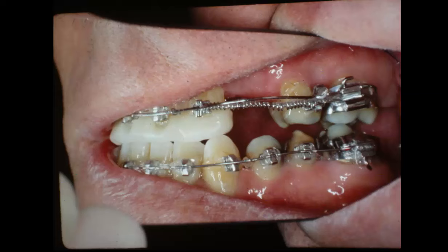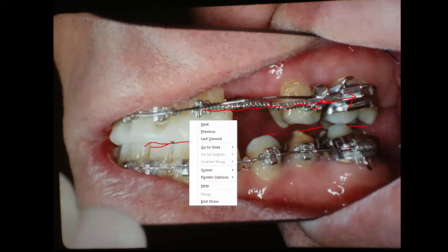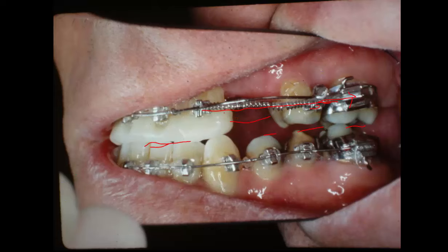Now, this is a little blown up deal, but while we were opening this bite, in other words, we had these teeth separated, we started expanding these teeth to the buccal. Also, I put a spring on the regular arch wire in here, and we're opening the gap where these teeth were missing, where it was closed up. So there's a whole bunch of things going on right here.